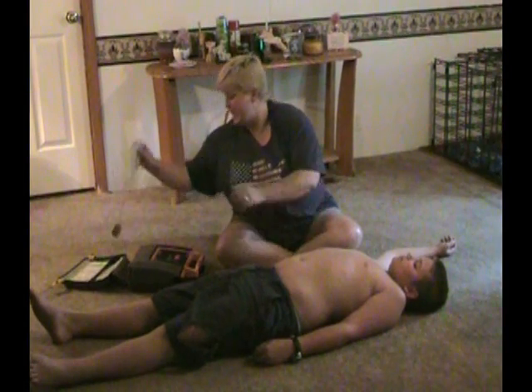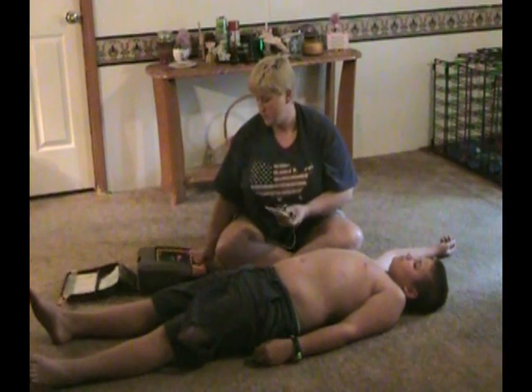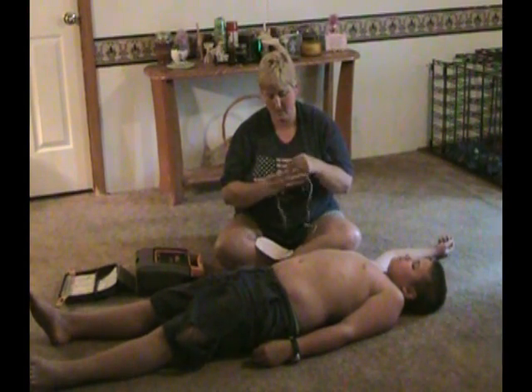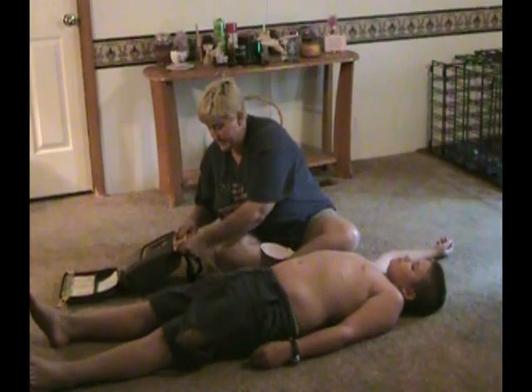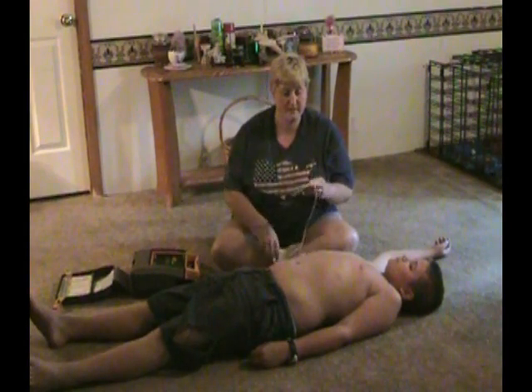You get your pads out. It's got detailed instructions inside. We'll turn the machine on. Connect electrodes. These are your pads, and it's got a picture on the machine of where to plug it in at. Plugged in. Next, we'll apply the pads to the victim.